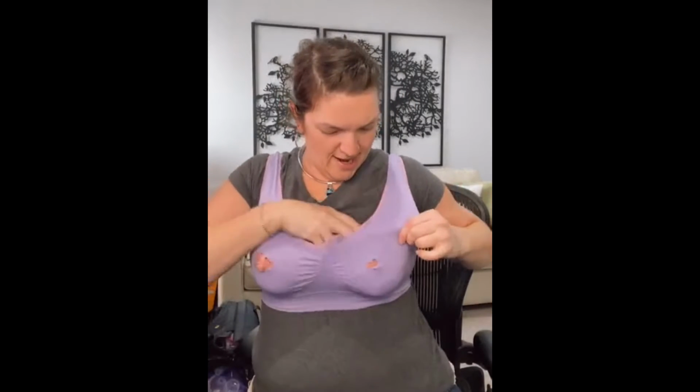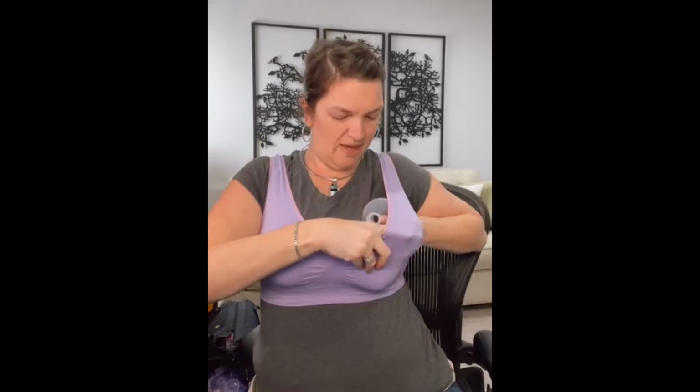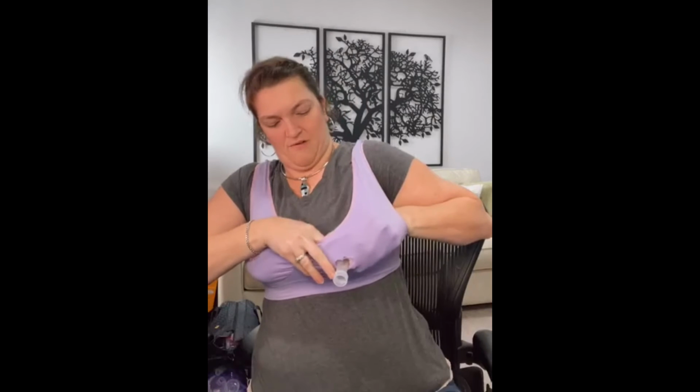Okay, so I'm going to have my one boobie on this side. There's my little nipple. I'm going to put this one on this side, and again, here's my natural nipple. If you're going with these flanges, obviously always better to go through the back so that you don't make the hole too big. So if you have a Medela or a flange that comes off, or a Lactec flange, a Pumpin' Pal flange, go through the back and then connect to your pump adapters. If you do happen to have the one-piece flange, then yes, unfortunately, usually you have to go through the front. Okay. Get things adjusted. Bada bing, bada boom. Sports bra into a hands-free pumping bra, okay?